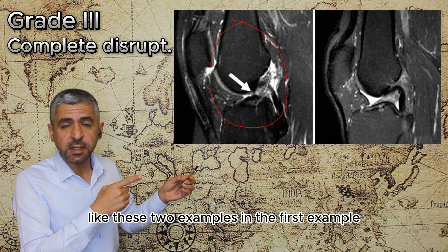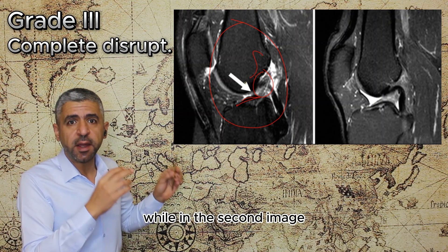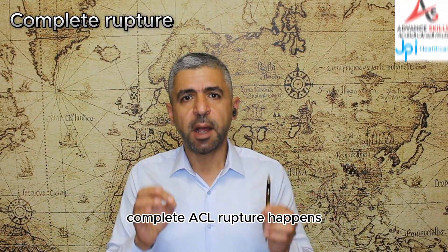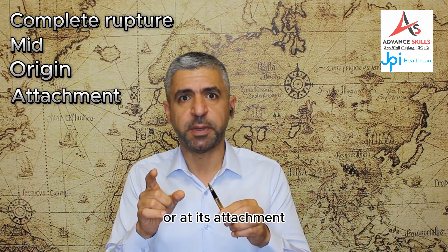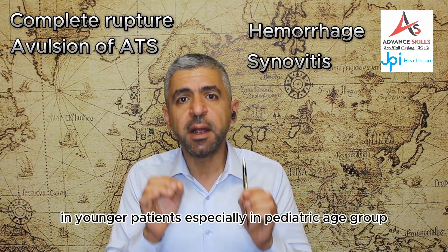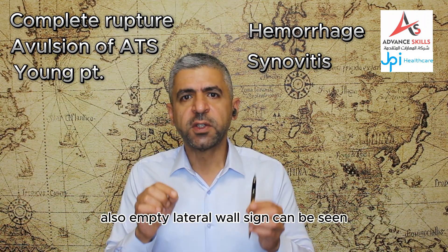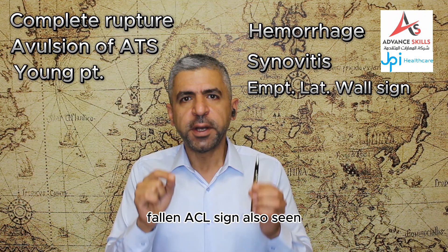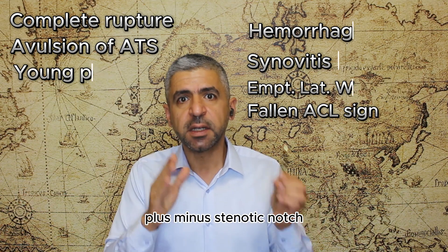In these two Grade 3 examples, the first shows complete ligamentous disruption while the second shows non-visualization of the ACL. Complete ACL rupture occurs with disruption at the mid-substance, origin, or attachment, associated with hemorrhage and synovitis. Avulsion of the anterior tibial spine in younger patients, especially pediatric, can be an associated finding. The empty lateral wall sign — absent attachment to the lateral femoral condyle — and the fallen ACL sign — loss of normal tension plus or minus a stenotic notch — can also be seen.